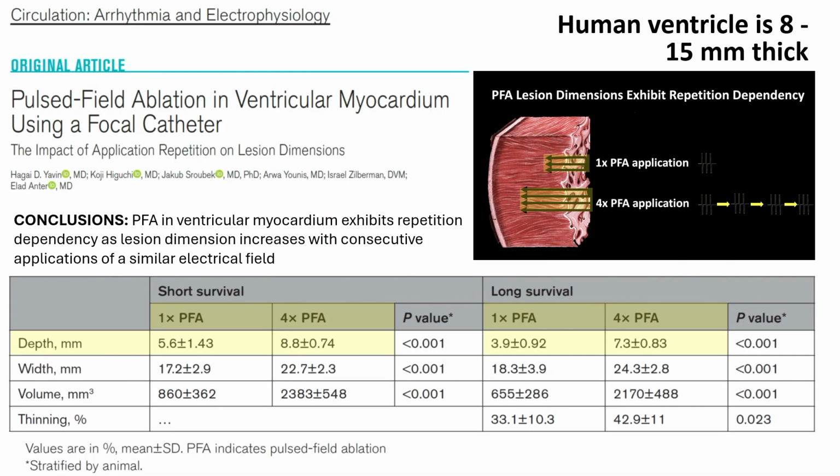Atria have very thin walls, so the target is very low, I would say. We want to go deeper. Okay, so what can we do? There are many papers which try to convince us that what we do is basically apply more.